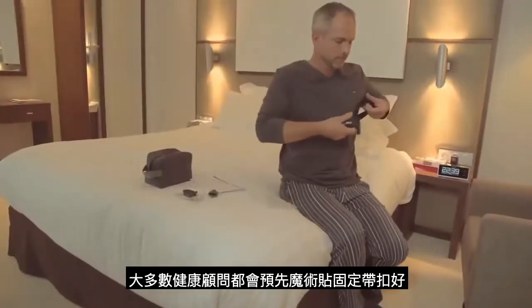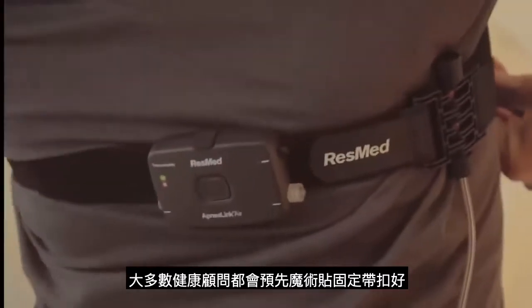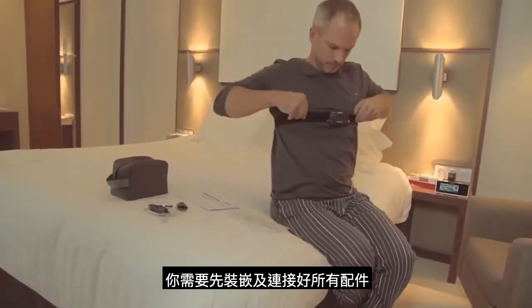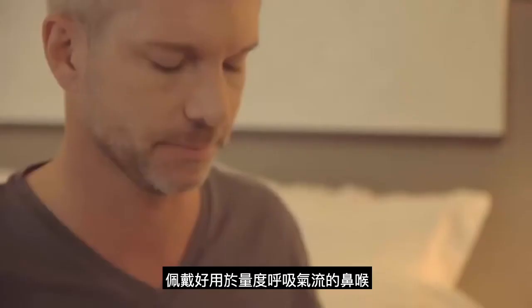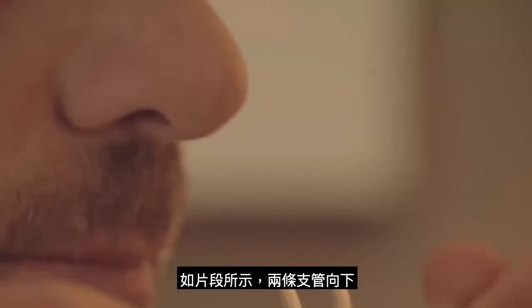The ApneaLink Air recorder and effort sensor will most likely already be attached to the Velcro belt supplied. Before you go to bed for a normal night's sleep, you need to assemble and attach the components. Take the nasal cannula, which measures airflow, with the two prongs facing downwards, like this.